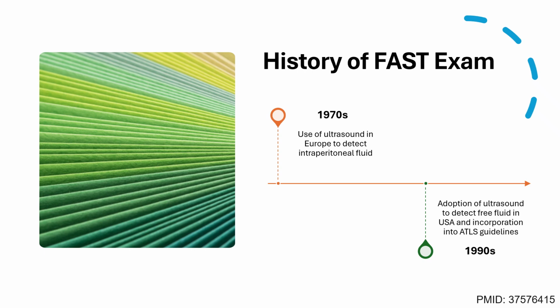So let's review a basic history of the FAST examination. In the 1970s, the use of ultrasound was described in Europe to detect free intraperitoneal fluid, and this was adopted in the 1990s in our country and also incorporated in the ATLS guidelines. Again, it is important to give credit to our trauma surgical colleagues and emergency medicine colleagues for helping to advance this exam and practical point-of-care ultrasound in an unstable patient.